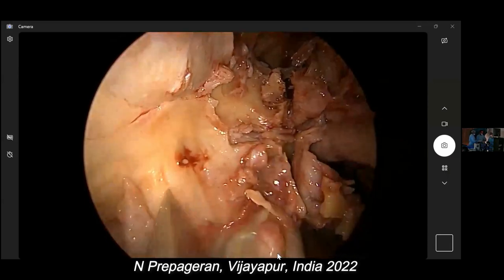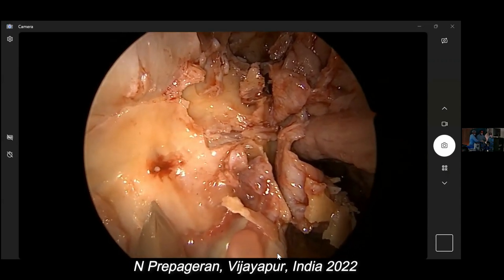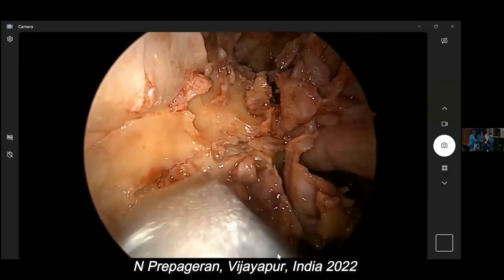Usually the bone here is very thin, but this uncle's got very thick bone. Bang. My goodness. Bang, bang. Have you seen such thick maxillary wall? Bang. It's common in India, right?